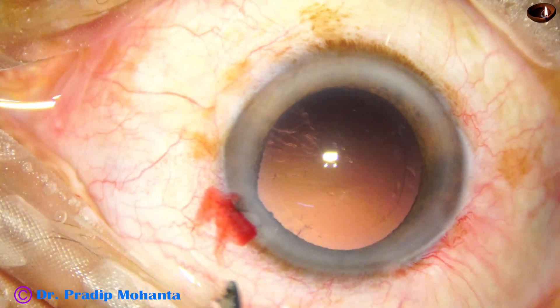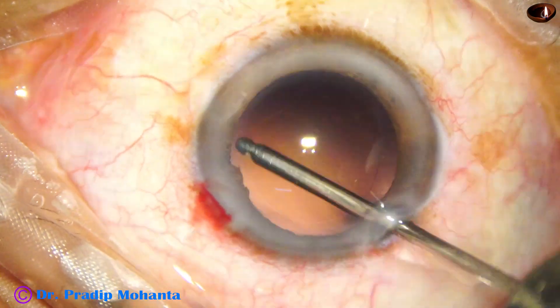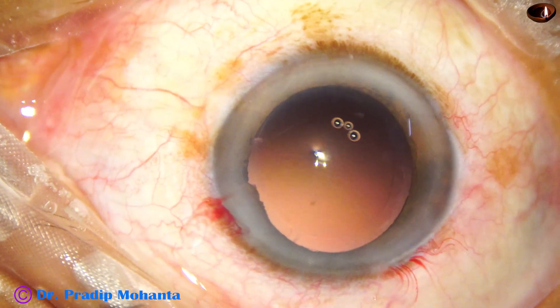I can see there are some lens fibers sticking to the posterior capsule, and I am trying to polish the PC just with the irrigating probe, without using the aspirating cannula.